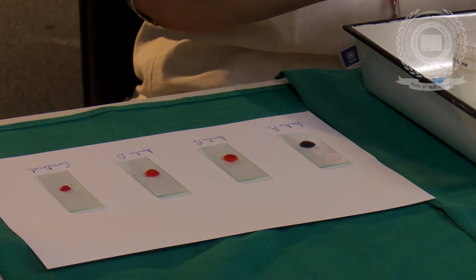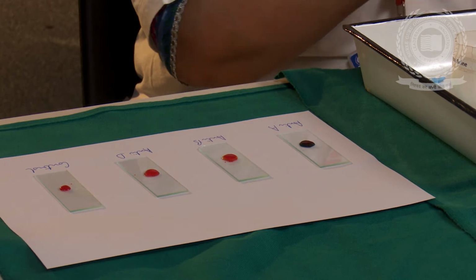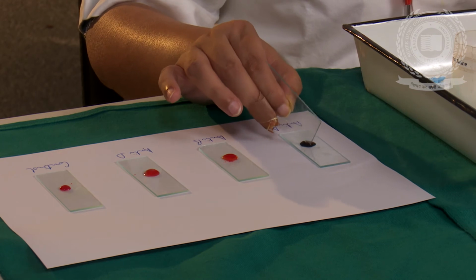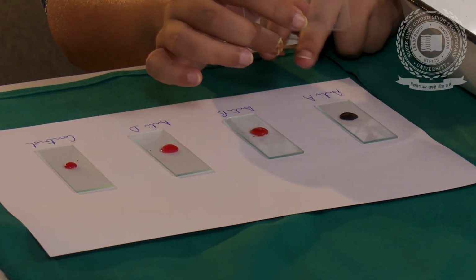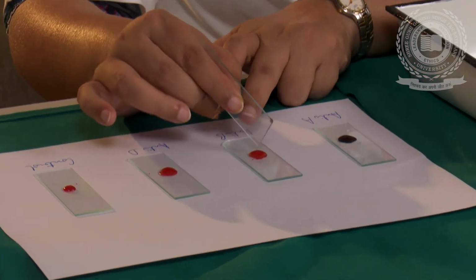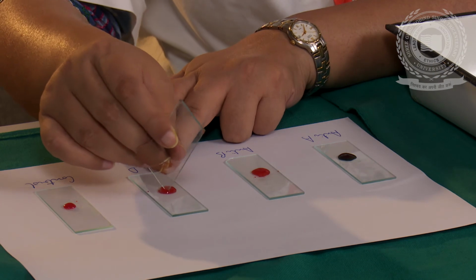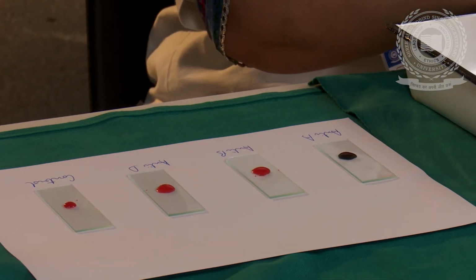As we know, in any scientific experiment, the control slide is not supposed to show any change. Then with the fifth glass slide, we mix these two solutions without spreading them, using different edges in order to avoid intermixing. And we wait for 10 minutes for the antigen-antibody reaction to take place.